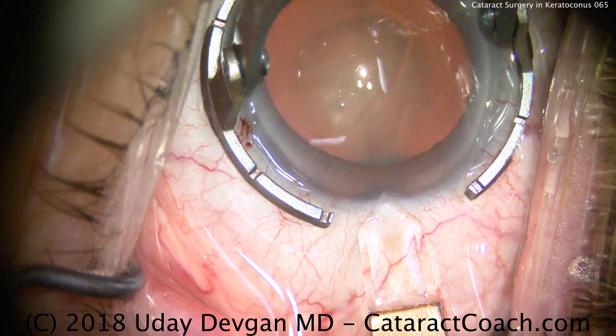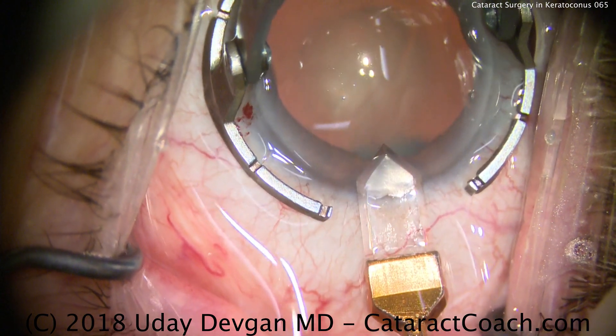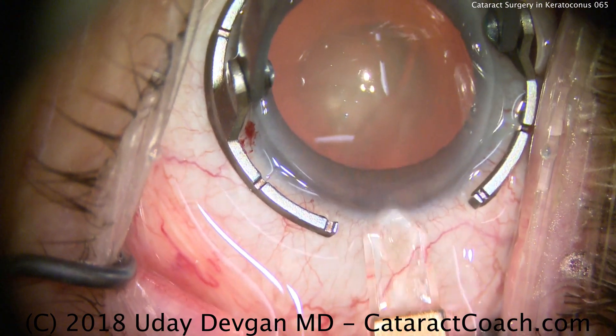When we make our incision, go very peripheral in a thick part of the cornea like this, and make it a sufficiently long tunnel length so it seals well.